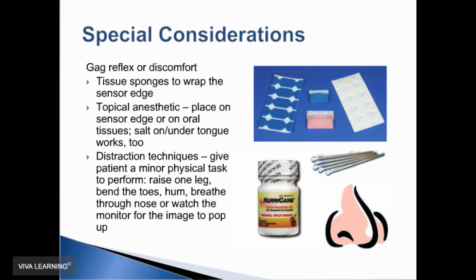To control the gag reflex, many clinicians like to use salt, with a little pinch of salt placed on the patient's tongue or under the tongue. And this seems to be very helpful in managing patients' gag reflexes.